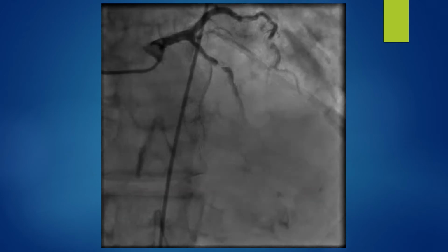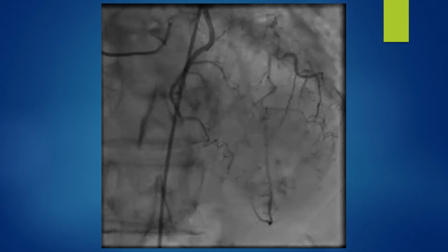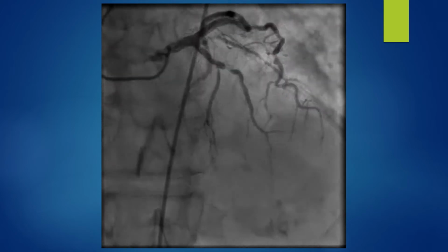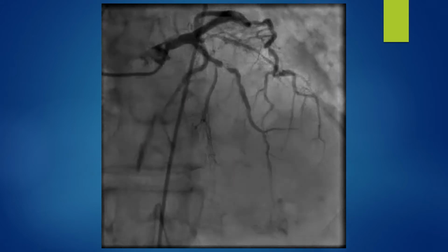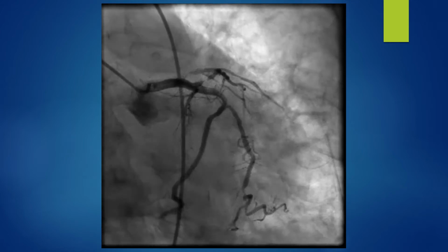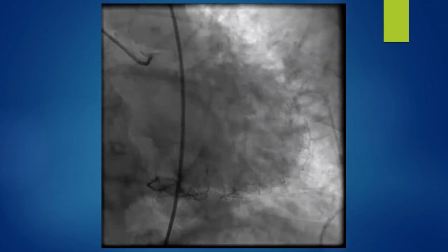So the angiogram shows that there is a subtotally occluded mid LAD, a subtotally occluded proximal ramus intermedius, and a subtotally occluded very distal OM branch, which is a small vessel and very tortuous beyond the occlusion. It's a left dominant system. The RCA was non-dominant. Here on this shot, you can see the ramus intermedius, which is 99% stenosed. All the vessels are heavily calcified.